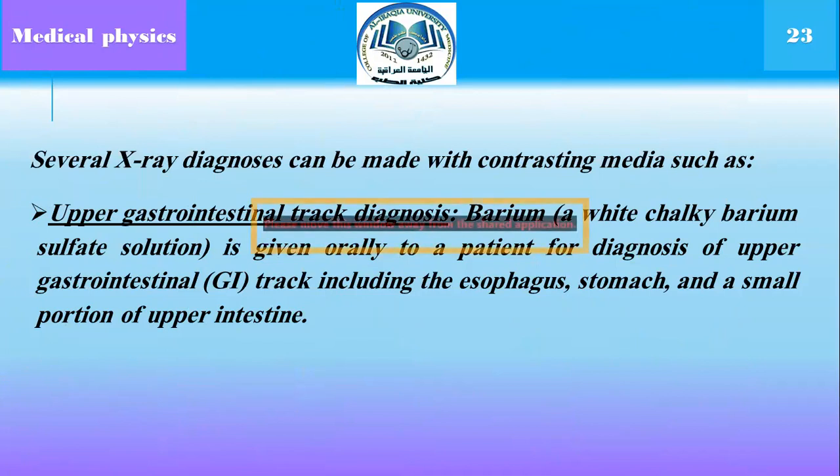In this case, the barium is given orally to a patient for diagnosis of upper gastrointestinal tract, including the esophagus, stomach, and a small portion of upper intestine.